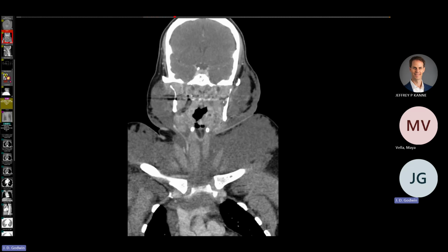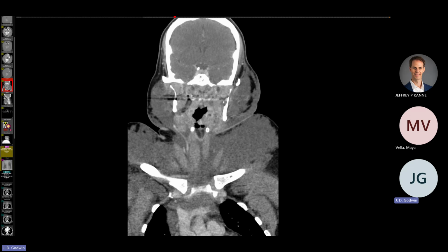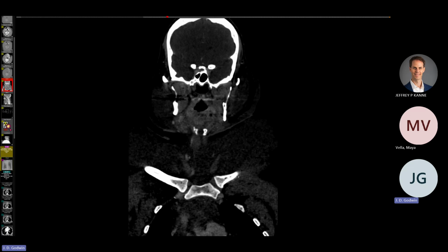So what do you think? Is it like a giant lymphatic malformation? It is. Yeah. Is it Gorham syndrome? I always forget the name of it. Well, the main thing with Gorham's is you have to have bone involvement. That's right. And this person doesn't have any bone involvement except maybe secondarily. I think there was a little thing in here in the clavicle, but nothing very impressive. So it's not really much bone.